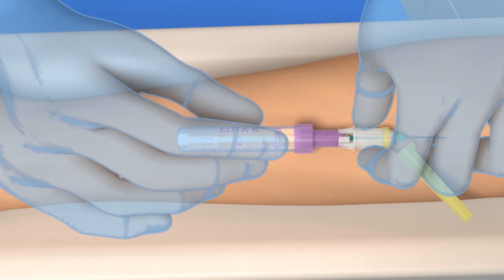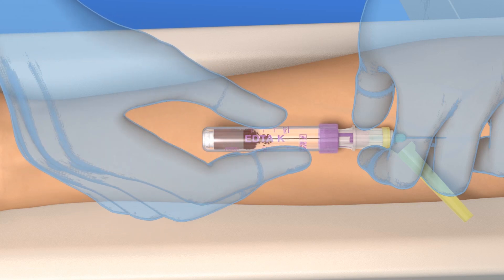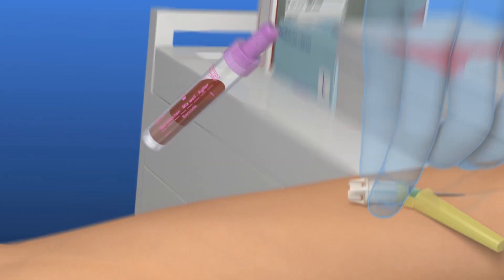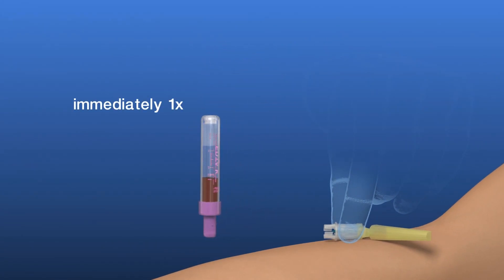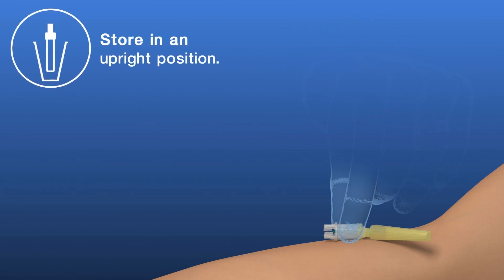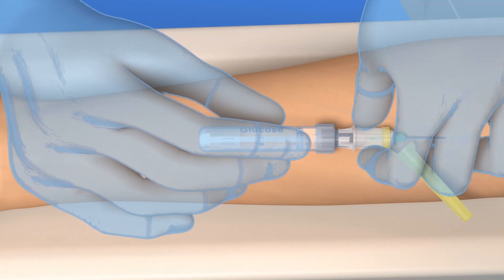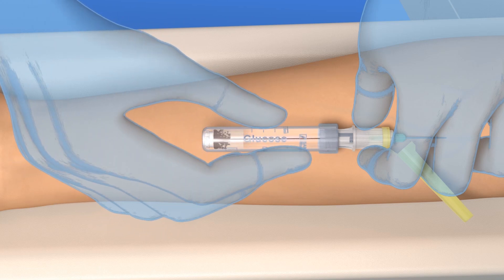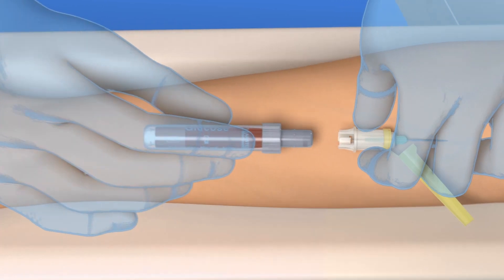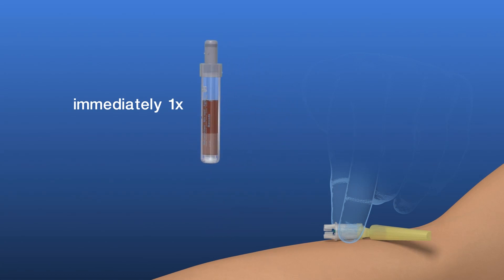Connect the first pre-evacuated S. Monovet to the safety needle and wait until the blood flow stops. Remove the S. Monovet from the safety needle and invert the filled S. Monovet once. Store it upright. Now connect the next pre-evacuated S. Monovet to the safety needle and repeat all the previous steps. Invert this S. Monovet once as well and store it upright like the other S. Monovets.